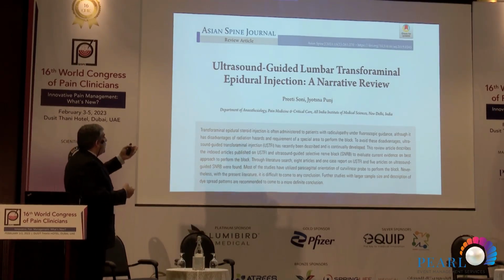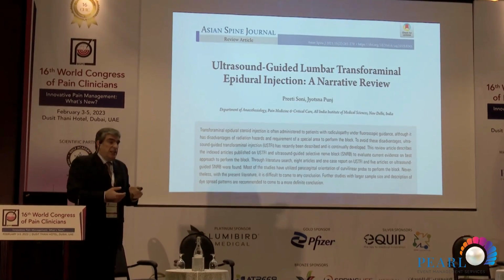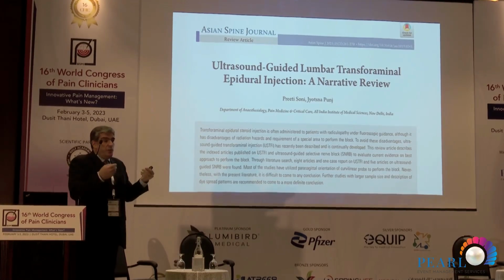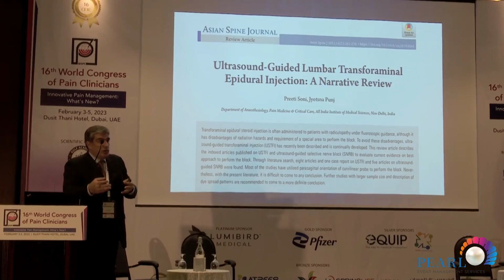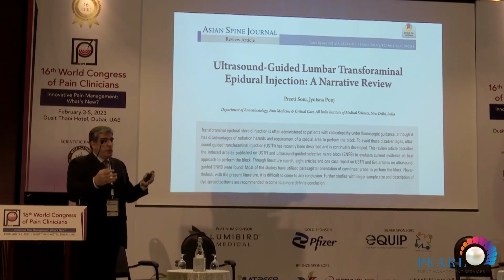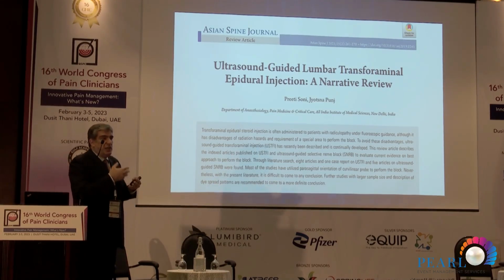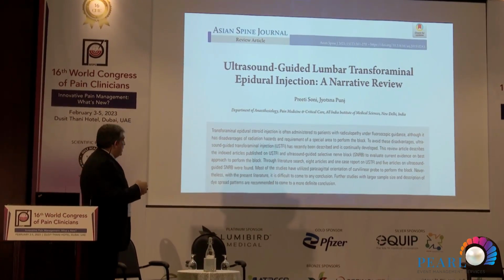This is a narrative review. We know that the ultrasound transforaminal technique was described in 2005. We have only a few publications on the subject, and all of them concluded that the best approach to ultrasound transforaminal injection is still to use fluoroscopy as a help to check for intravascular injection and for epidural steroid diffusion.